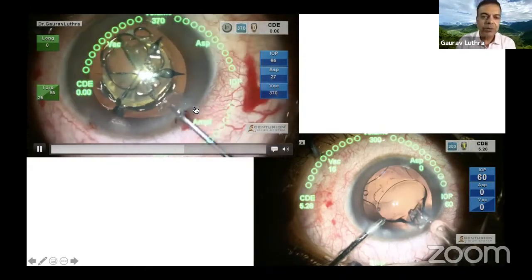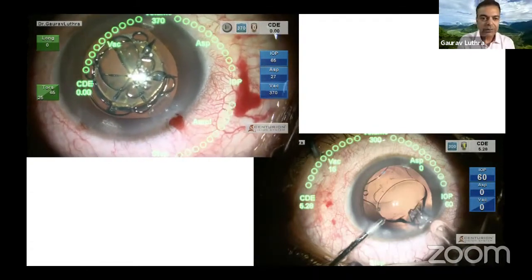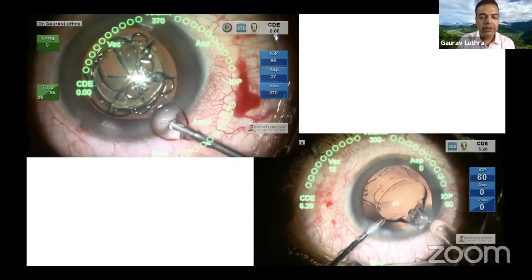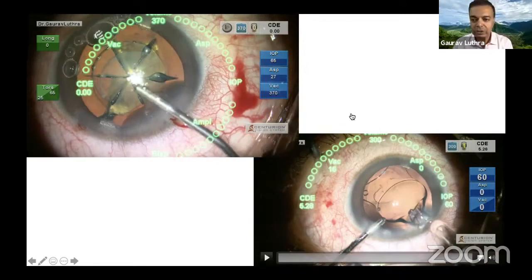So after years of doing this, I realized that my incisions with these keratomes that I currently use, the Mani ones, are so much more predictable and good in their construction and anatomy. I decided that I don't need to make femto incisions. Look at what happens now.